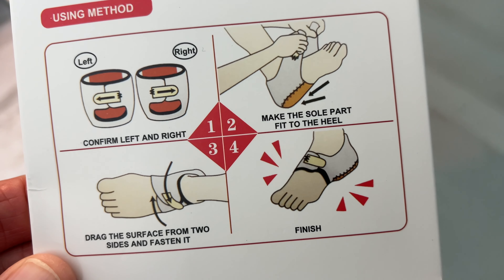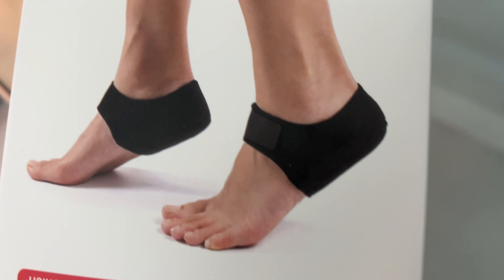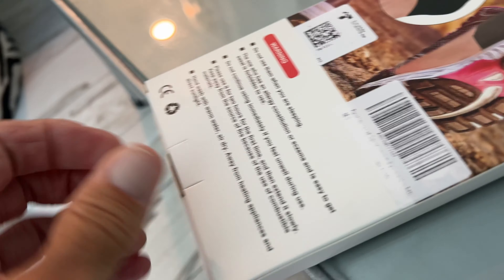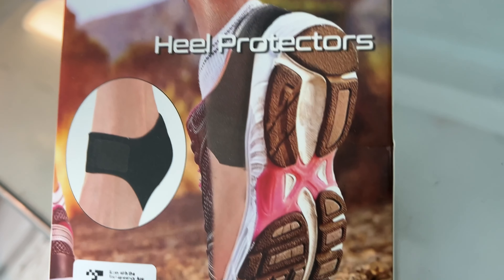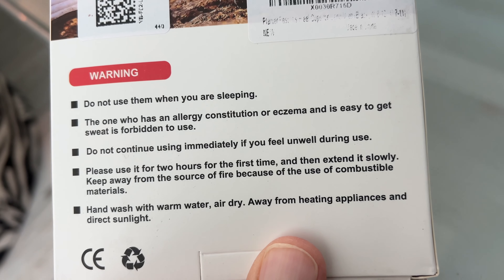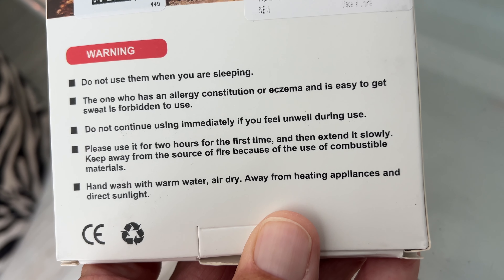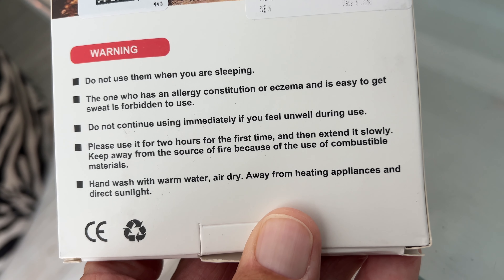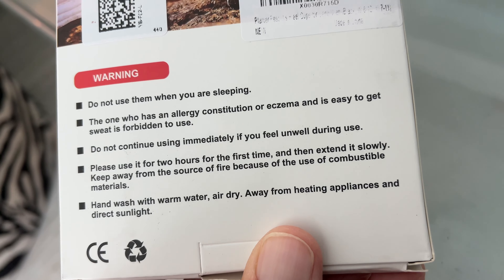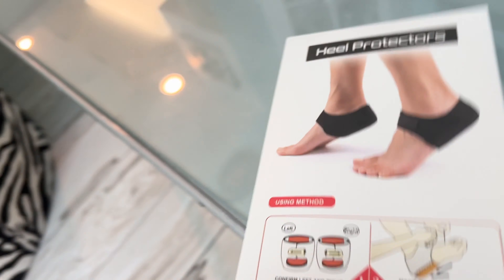They're supposed to be filled with gel and we're going to see if these things work. This is the box — it shows you all this stuff. Do not use them when you are sleeping. Two hours for the first time and then extend it slowly. Wash hands with warm water. Some weird stuff they're saying, but we'll try them out and see what happens.